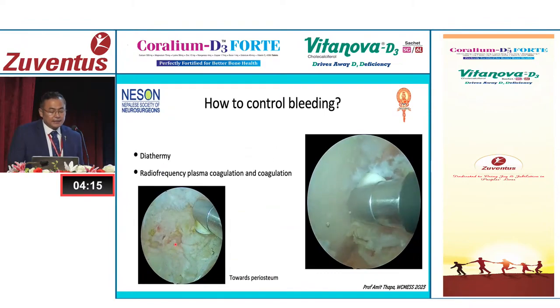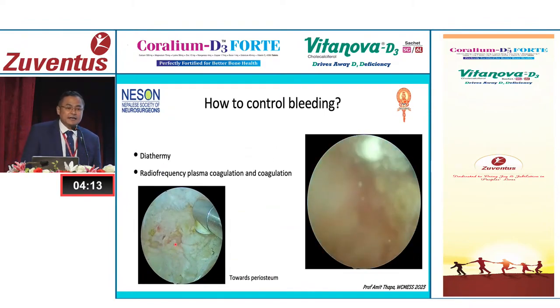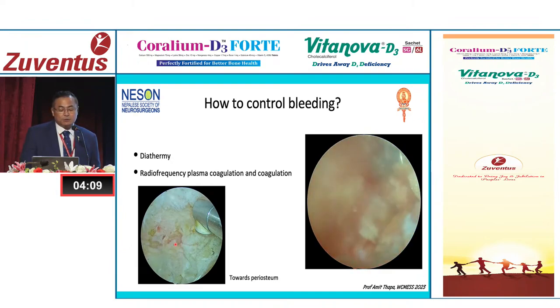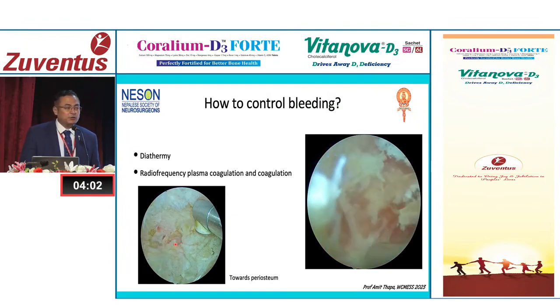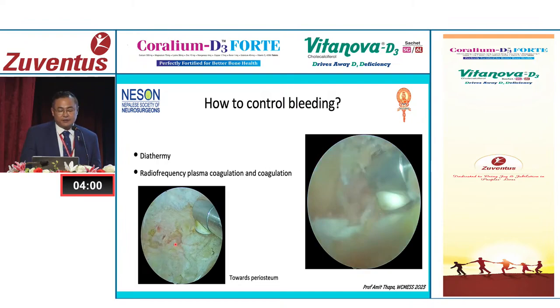And then there are many instruments like diathermy. Nowadays, diathermy has been taken over by radiofrequency plasma coagulation, which does not allow the temperature to go up, and it creates a very good field after some time. The only point to note is that we should use this RFA towards the periosteum, so that we do not pull off the epidural vessels, which can get stuck to these RFA devices.